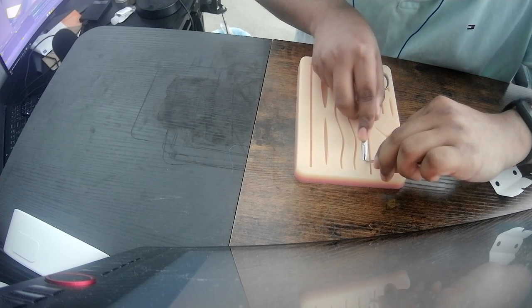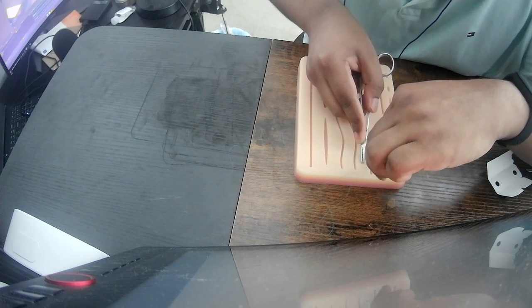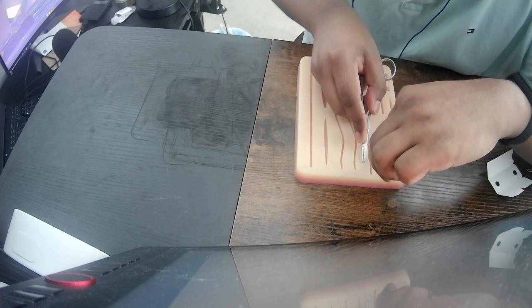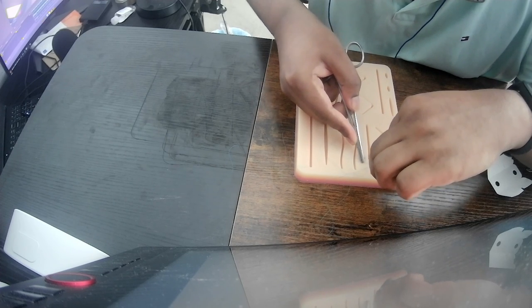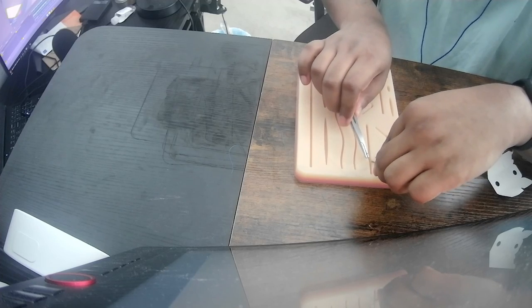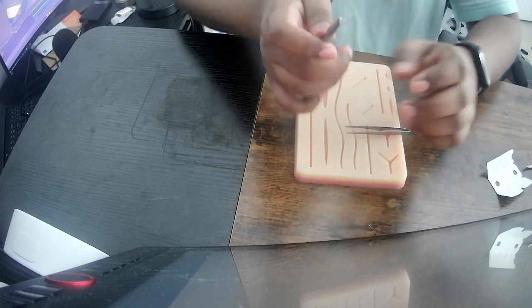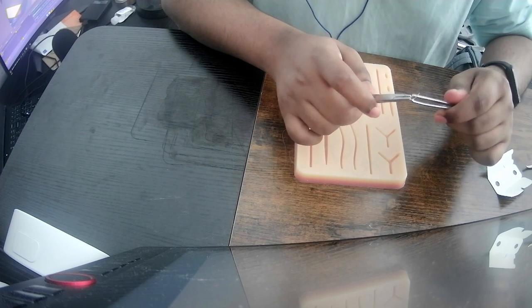Okay, this time I'll do a more shallow one. I think I dug too deep. Too far. And how do I even control it? Because it goes out of sight. And now the angle is messed up. I guess I loaded it wrong. Damn, let me retry. See? Yeah, it's not perpendicular. Okay. Let me try that again.